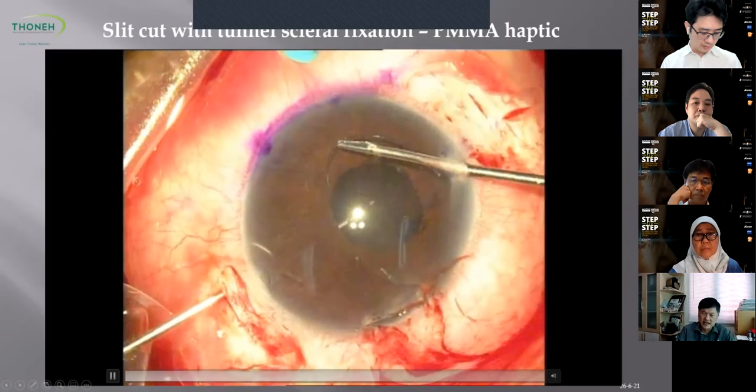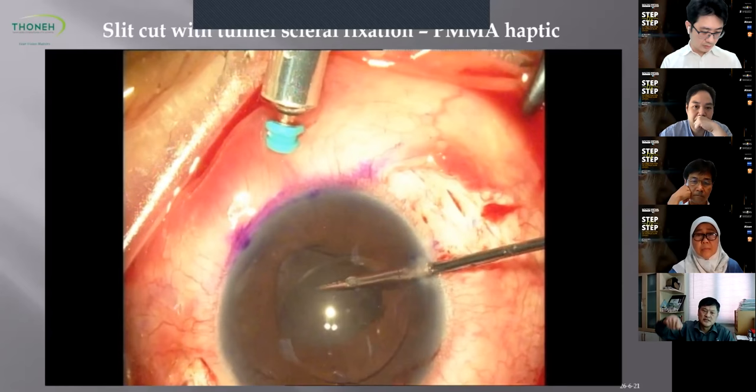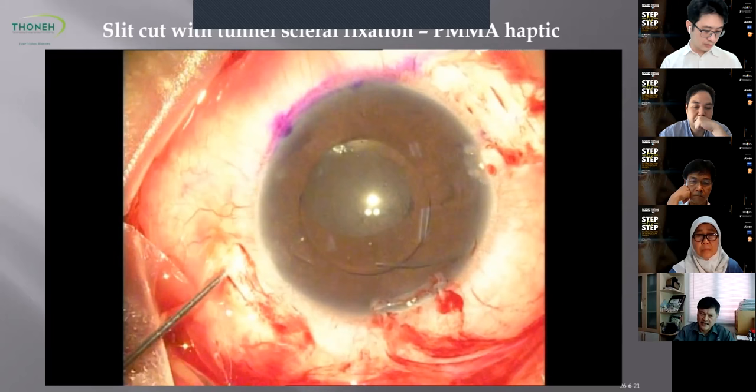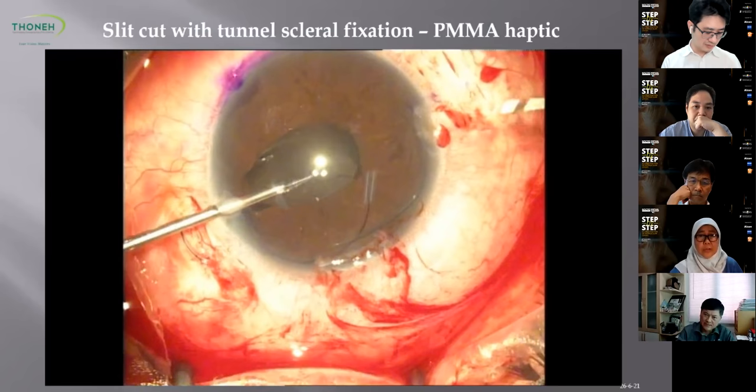When doing this maneuver, because the IOL is at the planar position, you must try not to tilt your forceps to externalize the haptic. You should pull the haptic out horizontally in order not to cause any distortion at the optic haptic junction.